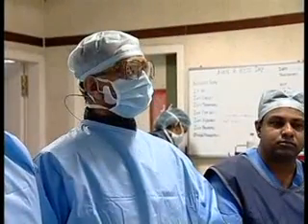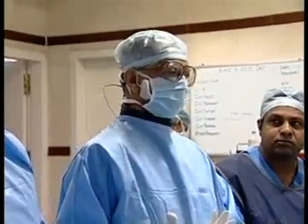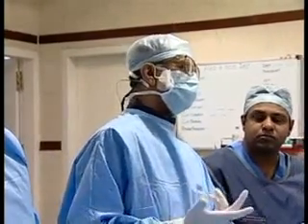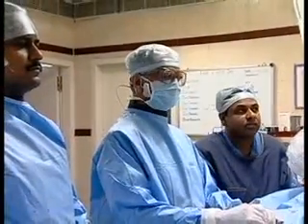How many sites to be ablated each side? Anywhere from 4 to 6. Basically we have just extrapolated from the Symplicity data. 4 to 6 lesions circumferentially around in each renal artery.